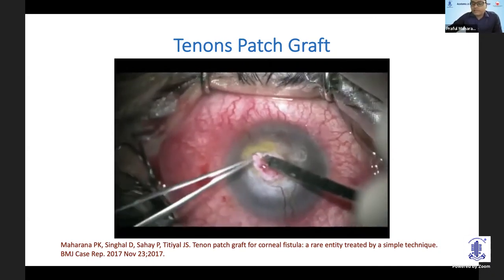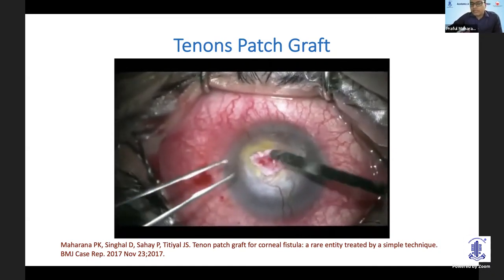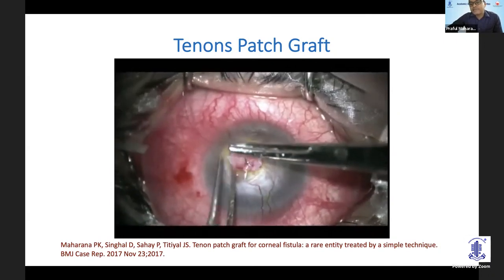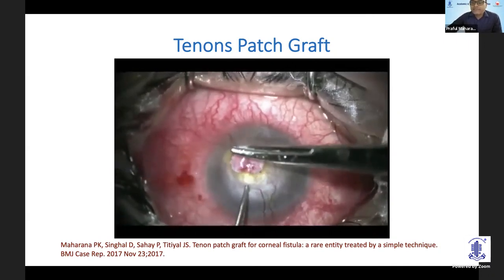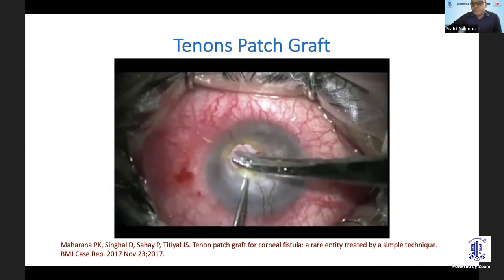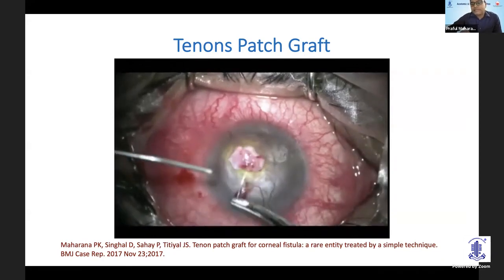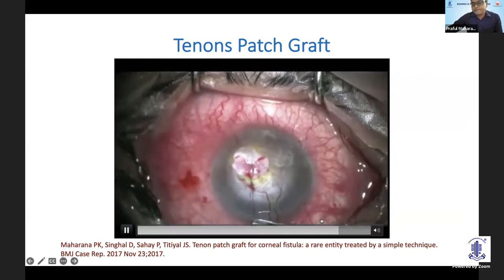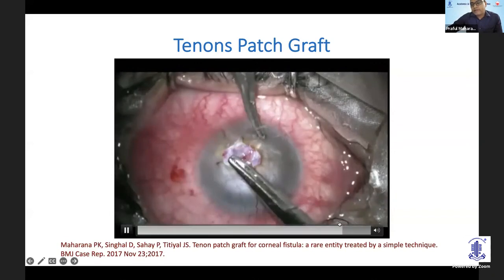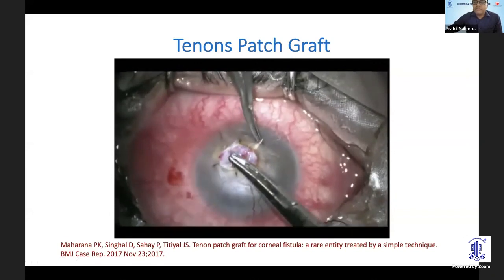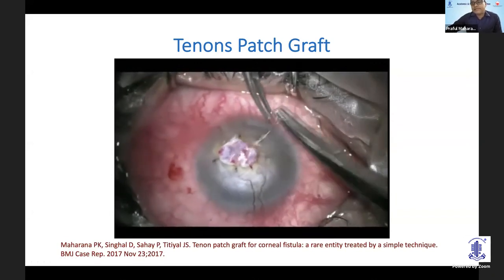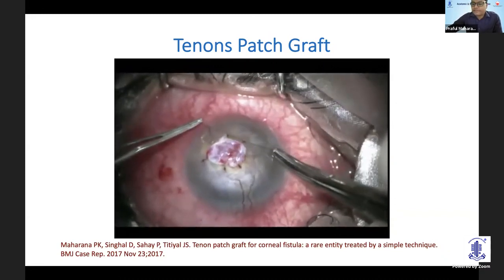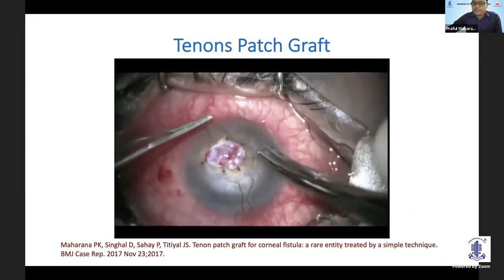For suturing, you can do any sort of suturing. I have seen many modifications of this technique. I prefer interrupted sutures because that allows me to adjust for any complication postoperatively. You must bury all the sutures. If you couldn't bury them and it's an acutely inflamed eye, you can simply put a BCL over that as well.